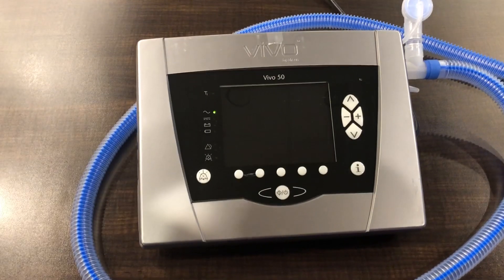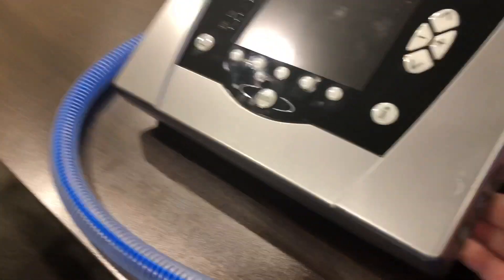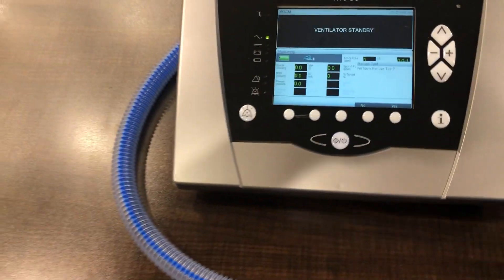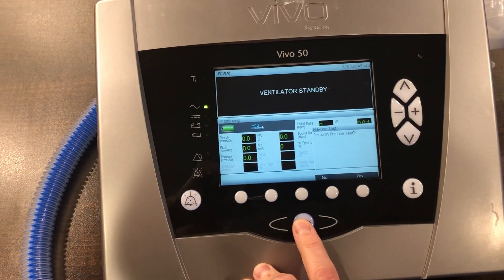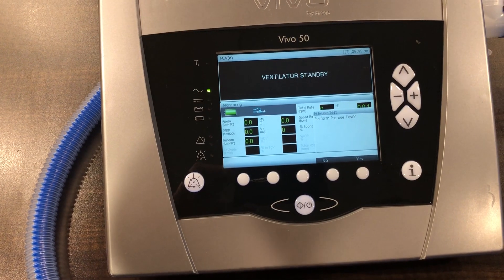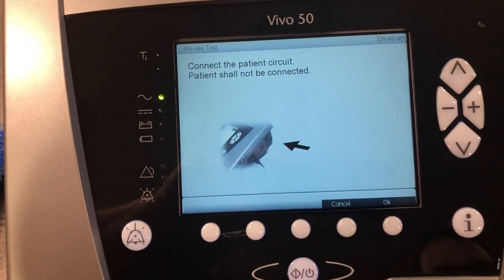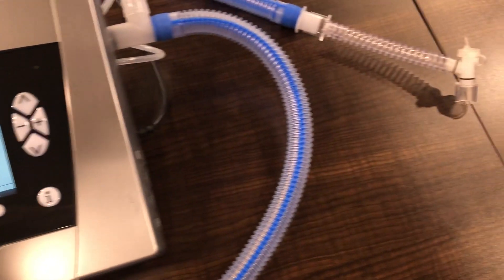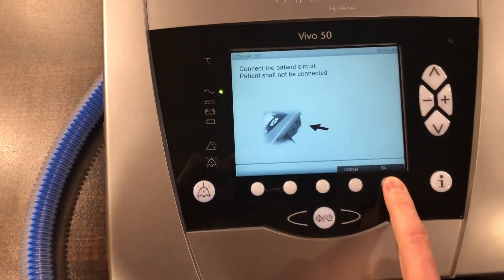The first thing we need to do is turn the unit on. You'll notice that it says ventilator on standby. We want to press that button right there and we get 'perform pre-use test.' We want to click yes and then follow the prompts. Connect the patient circuit — patient shall not be connected. You can see we do not have our test lung set up, so we're going to press OK.